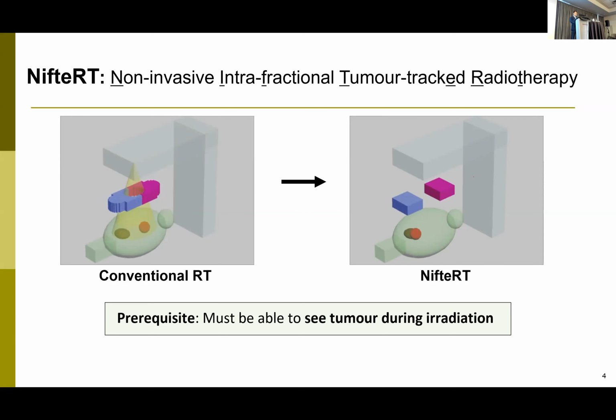So rather than doing this, what I'd like to do is called NIFT-RT. We coined this term, which stands for non-invasive intrafractional tumor tracked radiotherapy. Intrafractional here means during irradiation, okay?